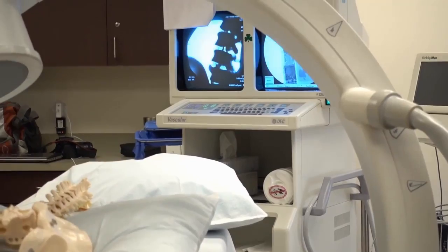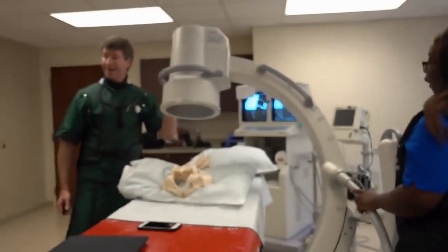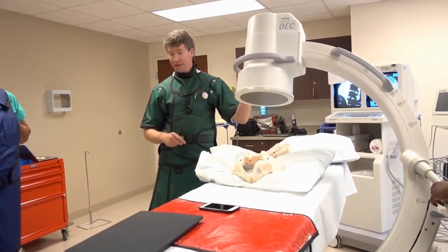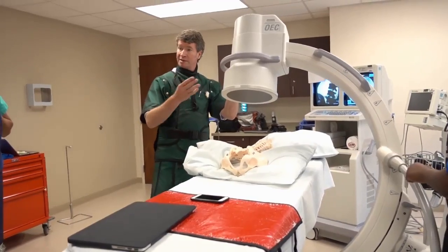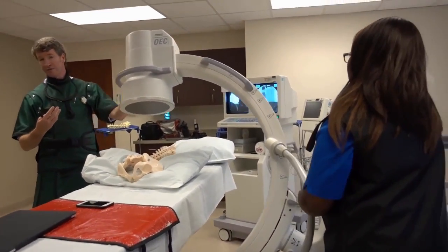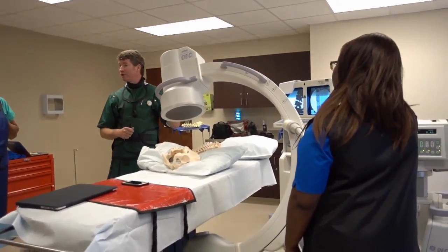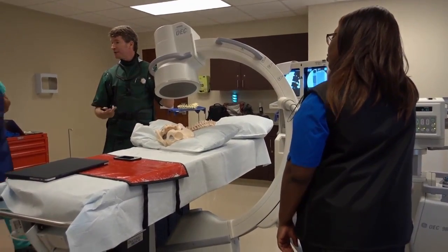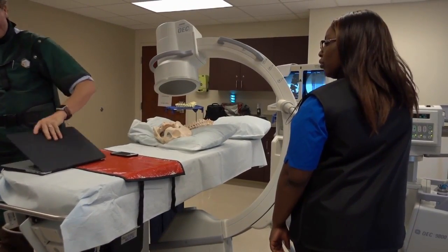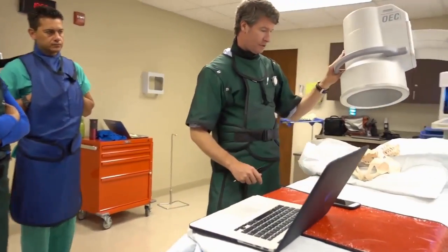But that's the concept. Some doctors, and I've done it this way many times, you just start AP. But most doctors like an oblique view. And of course, if we're going to do a right-sided transforaminal, you oblique to the right. If you do a left-sided transforaminal, you oblique to the left. How much is enough? Once you get that Scotty dog view, you generally have enough, and the doctor can work with it.